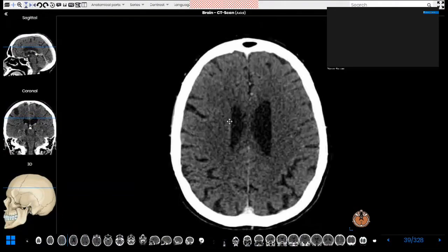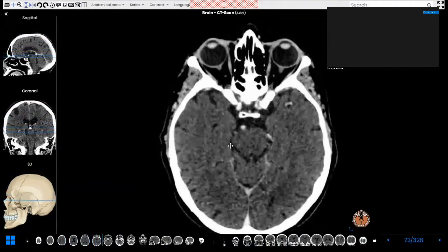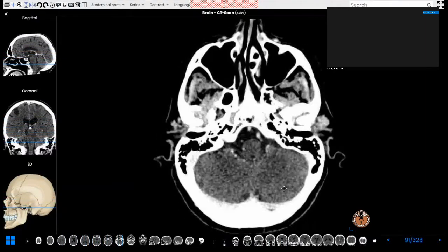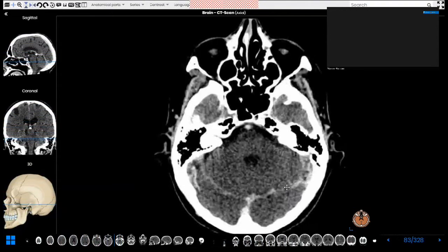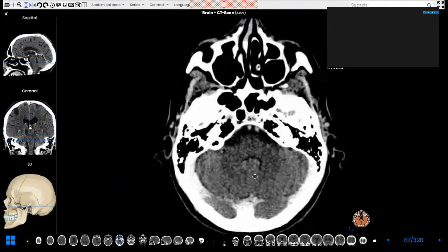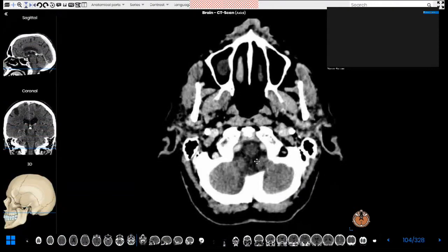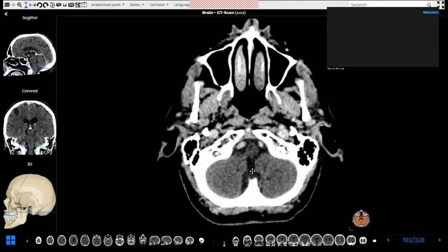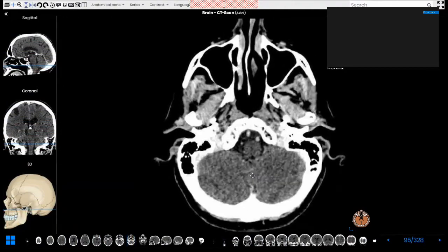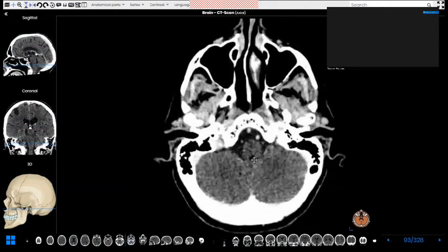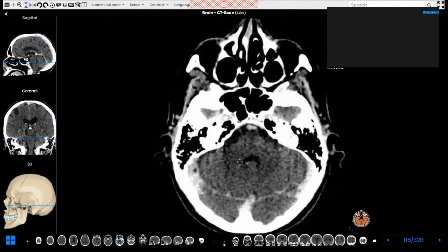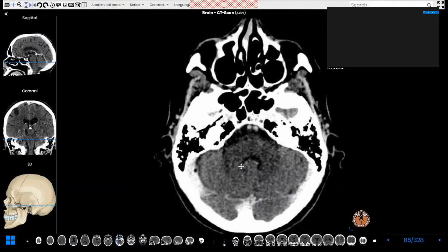The cerebellum is an infratentorial structure. These are both cerebellar hemispheres. In the midline is the vermis. When we scroll down, these are the cerebellar tonsils. This is a normal appearance — the cerebellar tonsils are not meant to be crowded around the foramen magnum. So in the midline is the cerebellar vermis, below are the cerebellar tonsils, and on both sides are the cerebellar hemispheres.